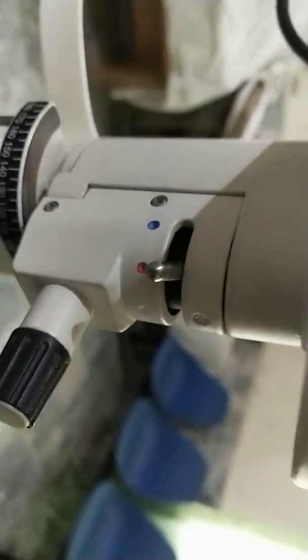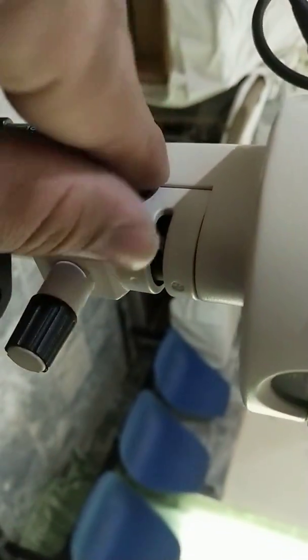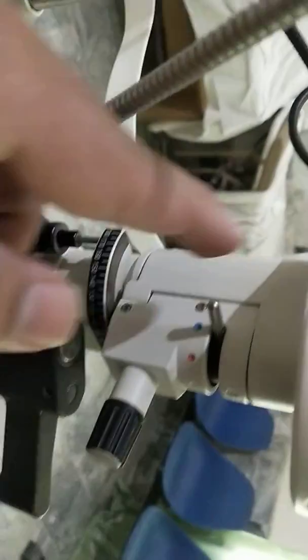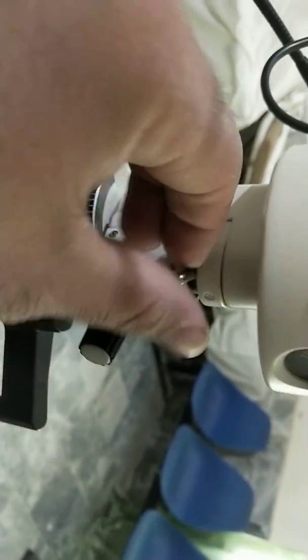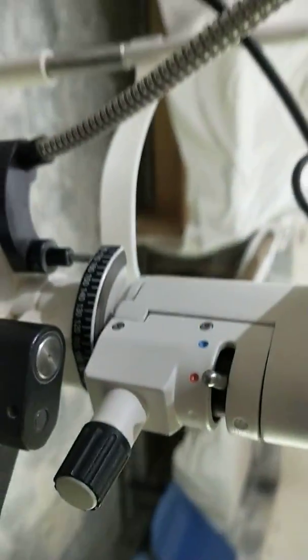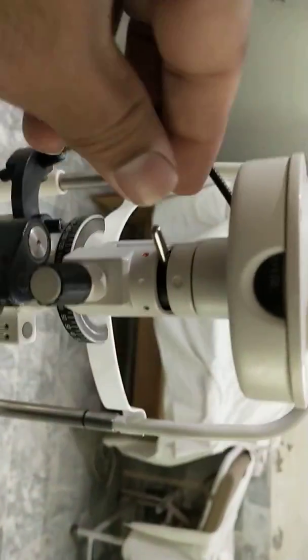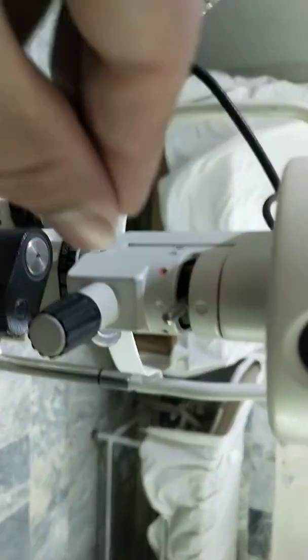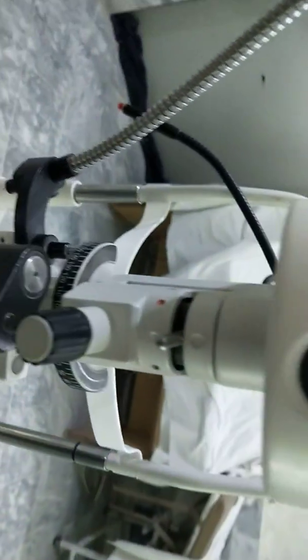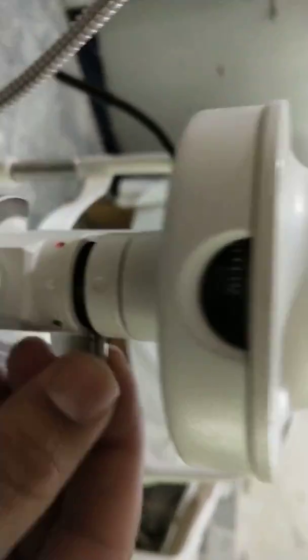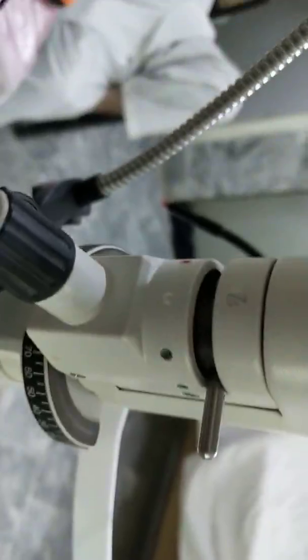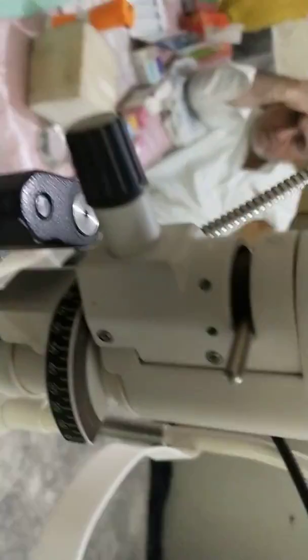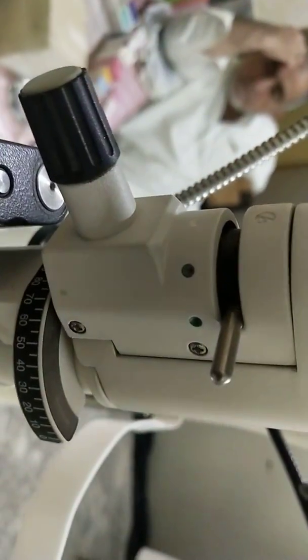Now here you can see the different types of filters. That is cobalt blue filter, that is red free filter, that's UV filter. So this one is the red free filter, this green one is the red free filter.